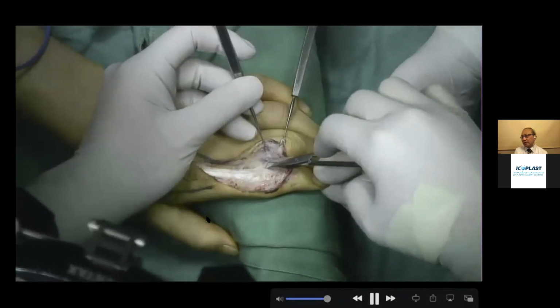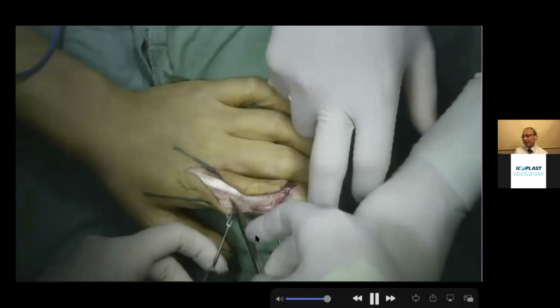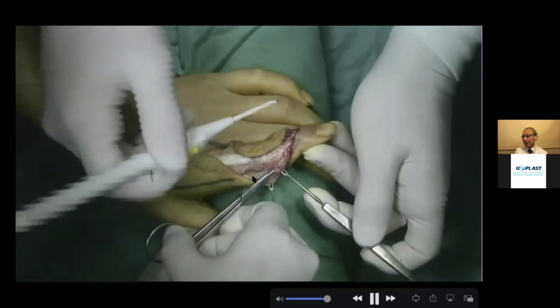Do use cautery here, because as we mentioned, the PIP joint will have more scarring, so it will be more difficult to dissect. And we have to do degloving circumferentially, which enables us to resect the PIP joint from the finger. But the scars here will be more difficult to approach, so we start from somewhere that is out of the injury zone, try to find the proper digital artery neurovascular bundle, and prevent them from injury.